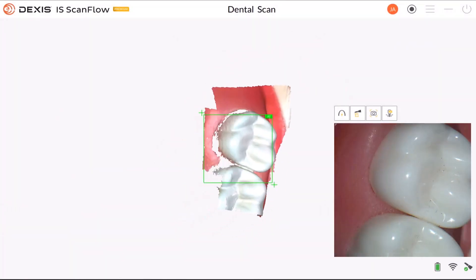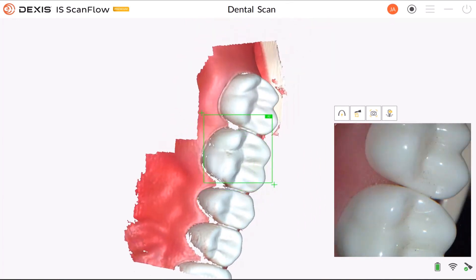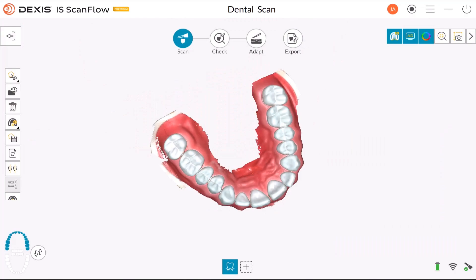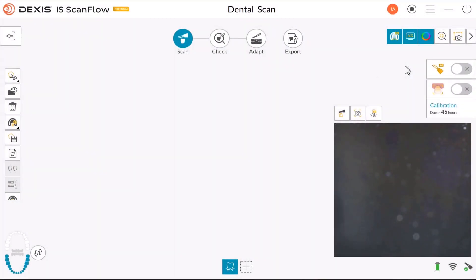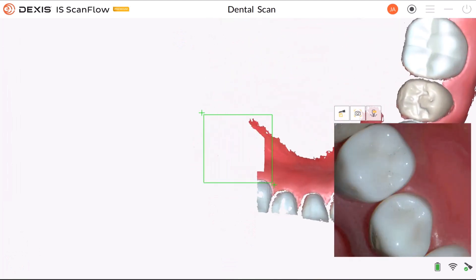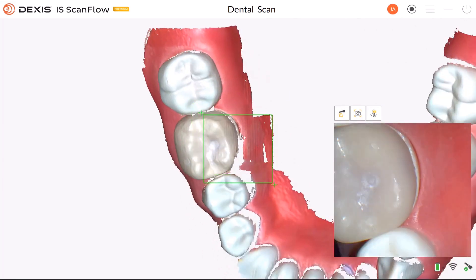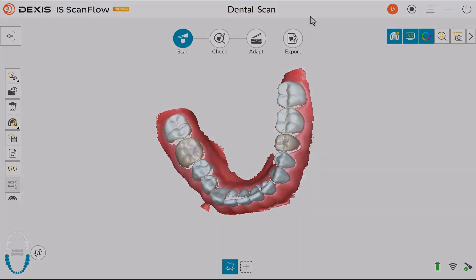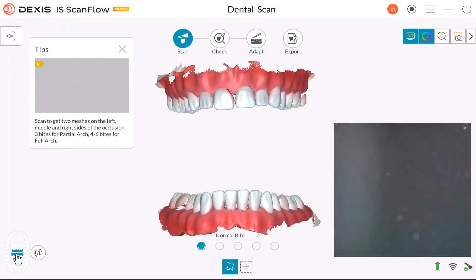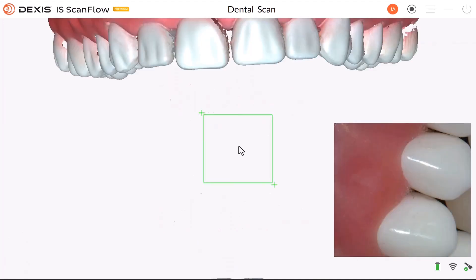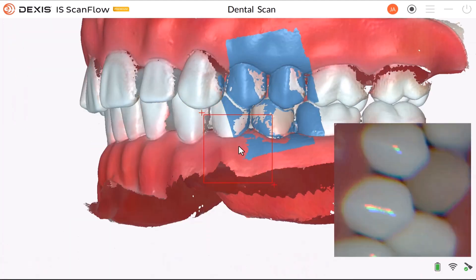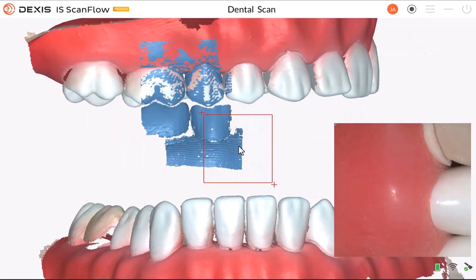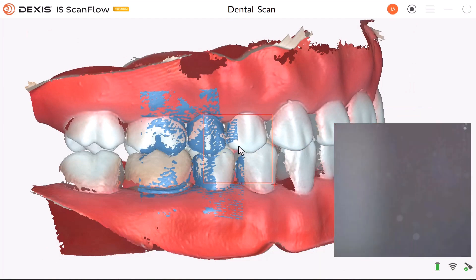Scan the upper jaw. Scan the lower jaw. Acquire the buccal bite registration.